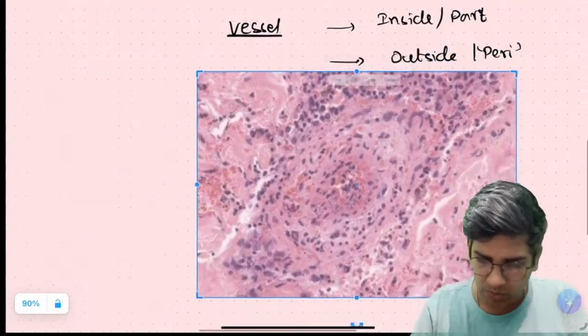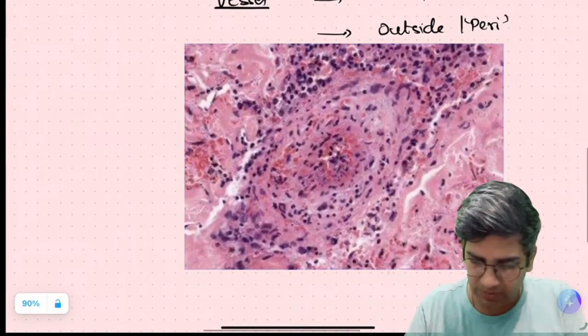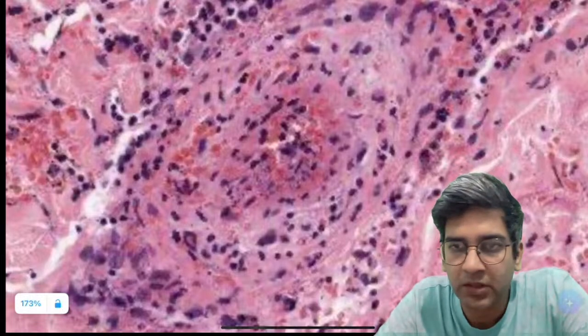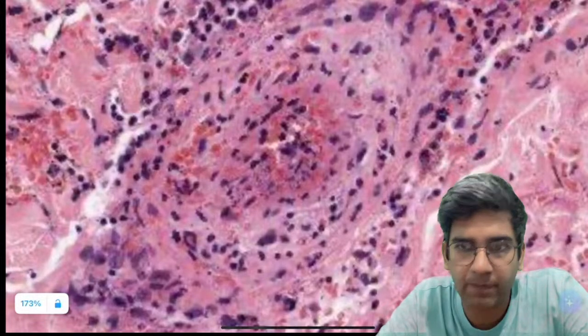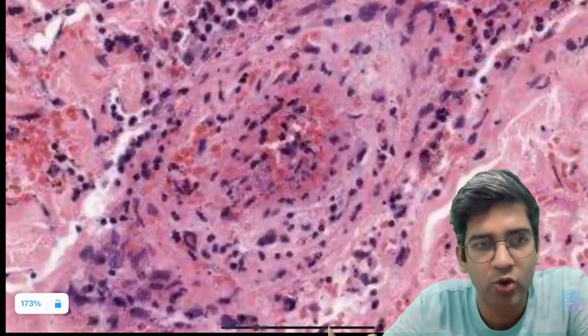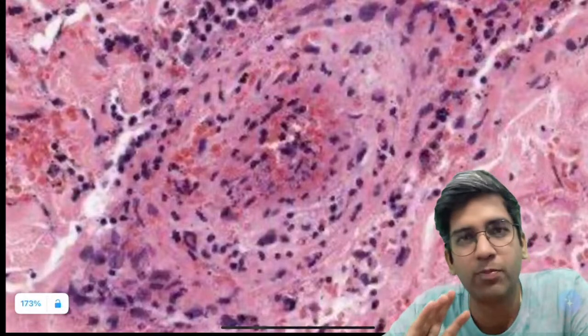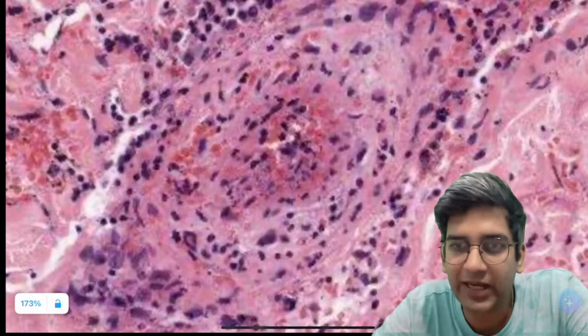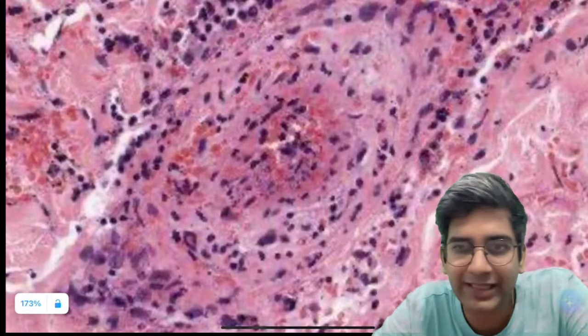So tell me, where is the problem? Is the problem in the vessel wall? Is the problem outside the vessel? Perivascular. Perivascular is outside. I want you to know whether it's a problem in the vessel or a problem from the dermis. That's a question. In the vessel wall, great. Do we agree with Hema, Janaldin, Praneet?